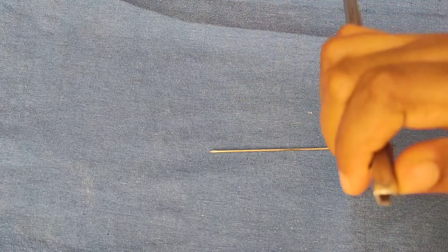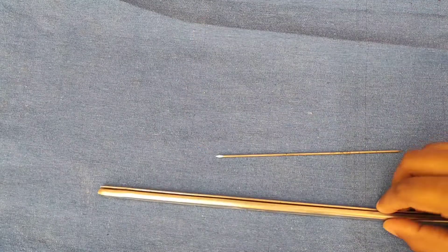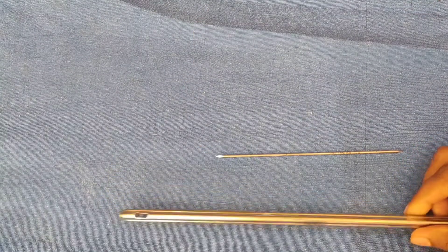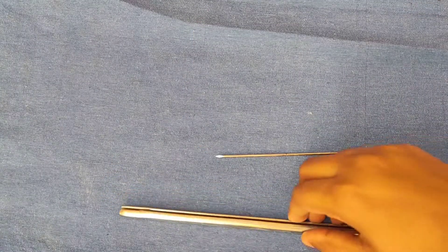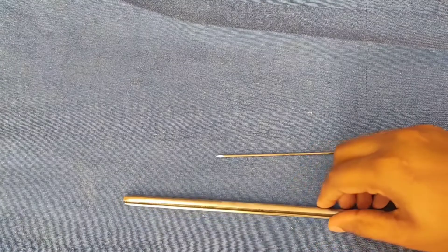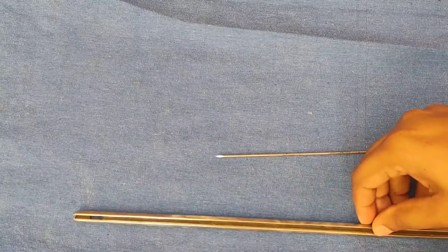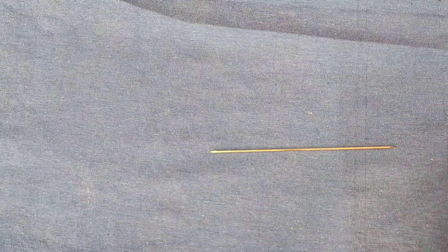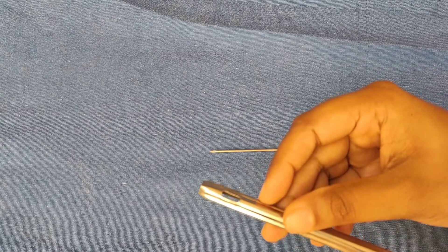It provides rotational stability. It is mainly used for fixation of shaft of femur fractures. You can see the eye which is helpful for extraction of the nail.